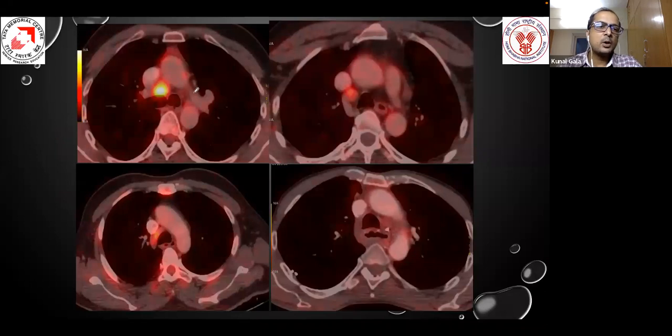So let's come on to a few of the live examples. This is the lymph node located in the central hilar region. Anteriorly, anterolaterally and anteromedially, on both sides, the vessels are located. One side is the pulmonary artery, one side is the SVC, and posteriorly is the trachea. So there is no window available for a percutaneous approach.